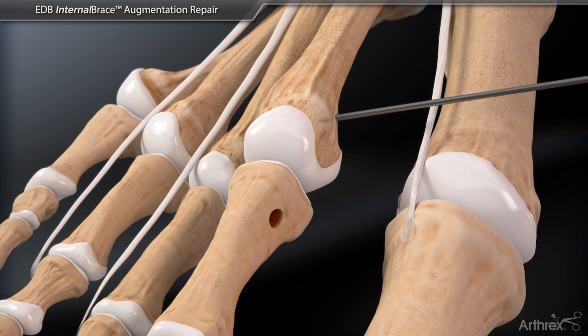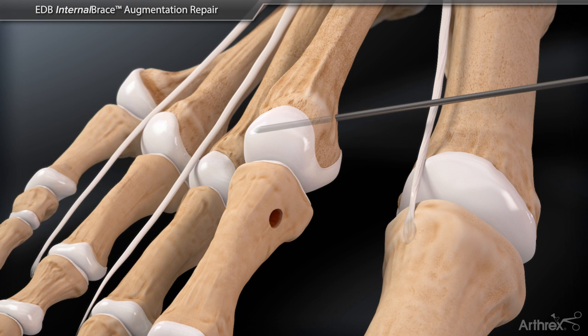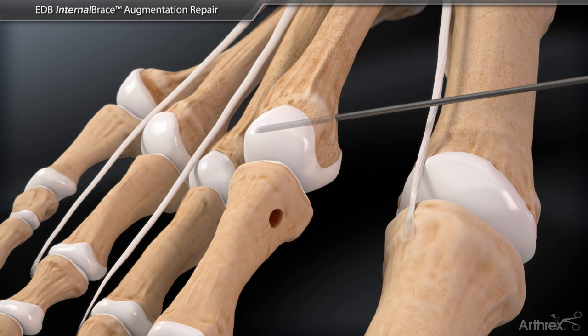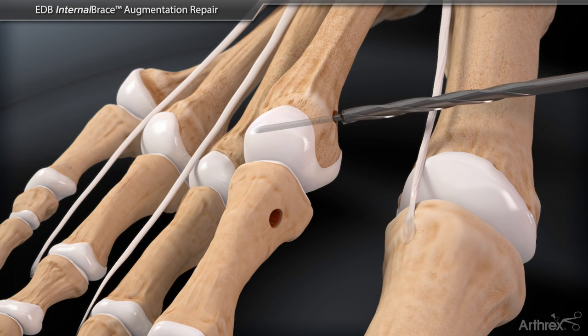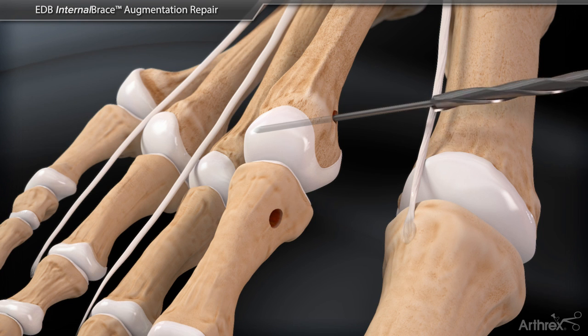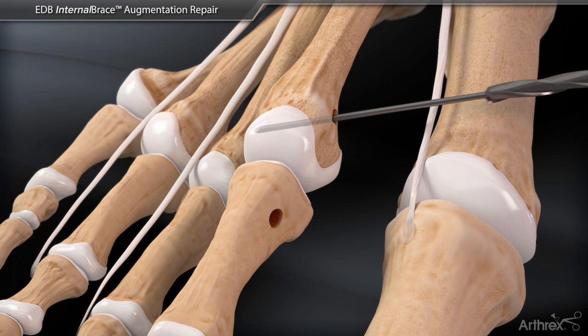Another guide wire is placed into the distal metatarsal just proximal to the articular surface from dorsal medial to plantar lateral. Proceed to initially drill through both cortices using the 2.5 mm cannulated drill bit, followed by an overdrill using the 3.0 mm cannulated drill bit.